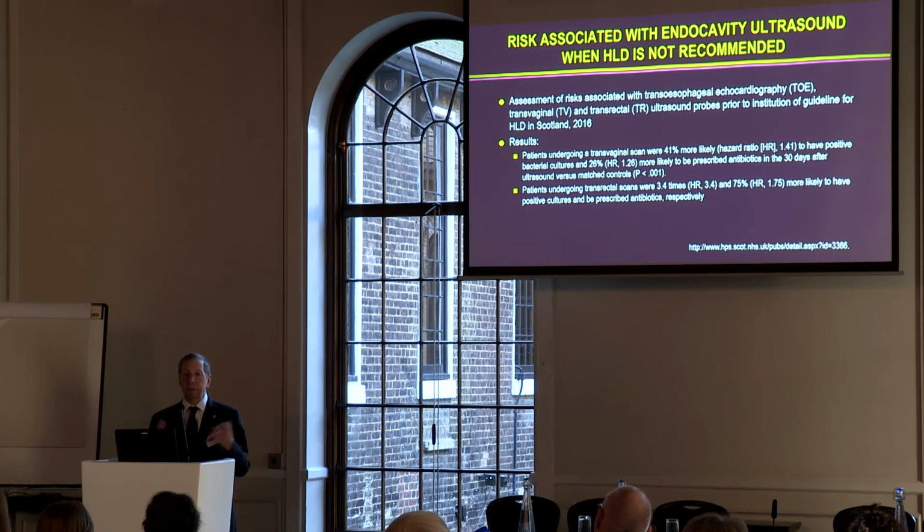Now, of course, these were ordinary organisms, and so they're not molecularly linked, so maybe all of these were really related. But again, you have a control group just showing you the importance of using high-level disinfection and the risks when you do not. Patients undergoing transrectal scans were 3.4 times and 75% more likely to have a positive culture and be prescribed antibiotics respectively.